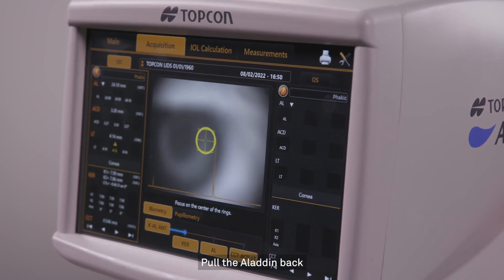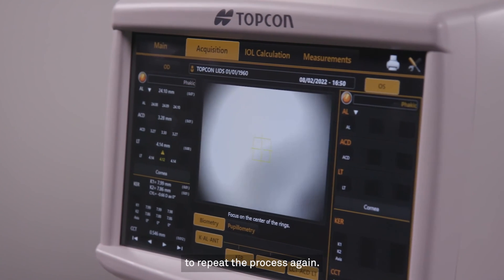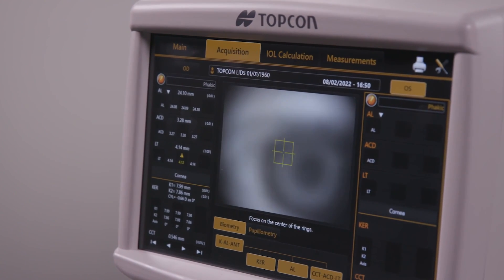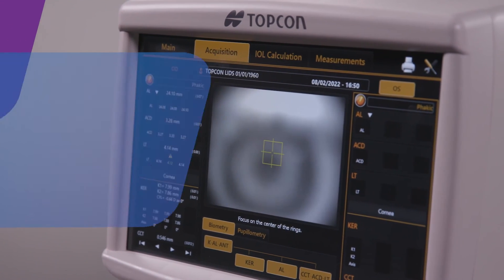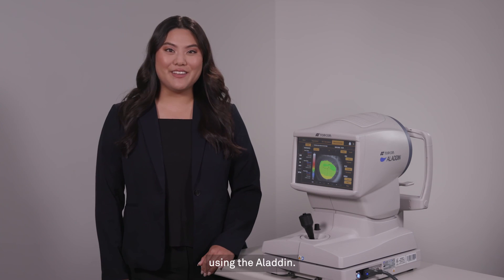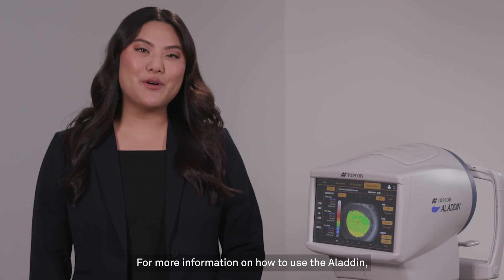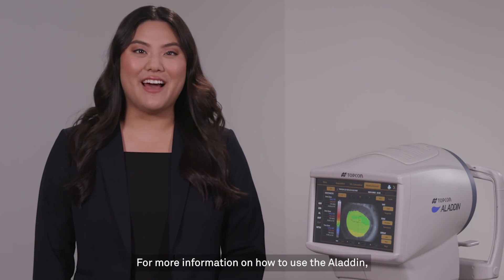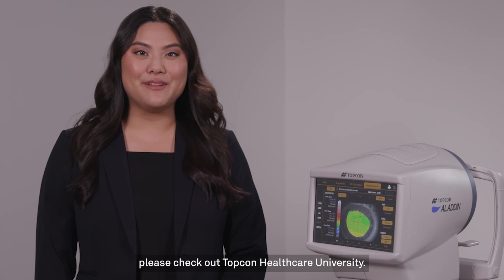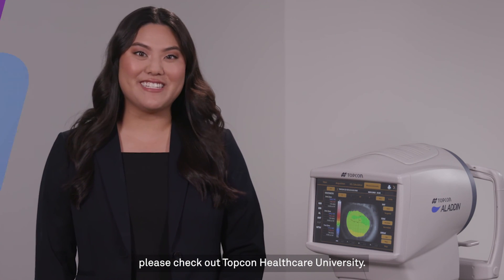Pull the Aladdin back and move to the fellow eye to repeat the process again. And that's how you capture data using the Aladdin. For more information on how to use the Aladdin, please check out TopCon Healthcare University.